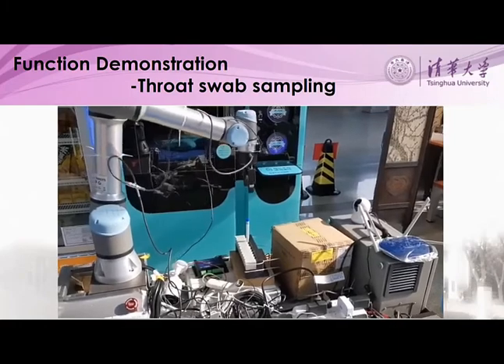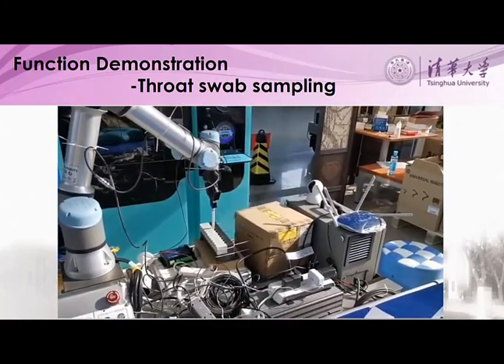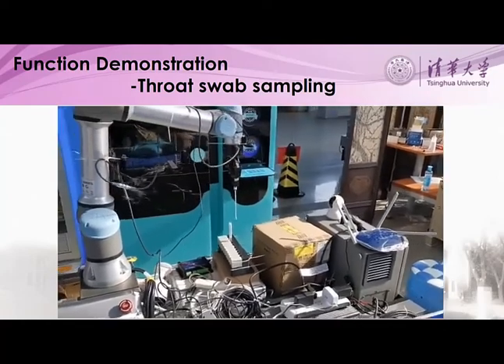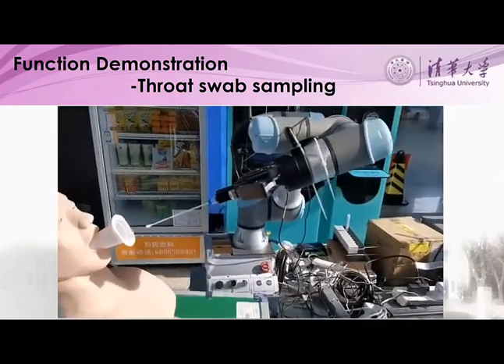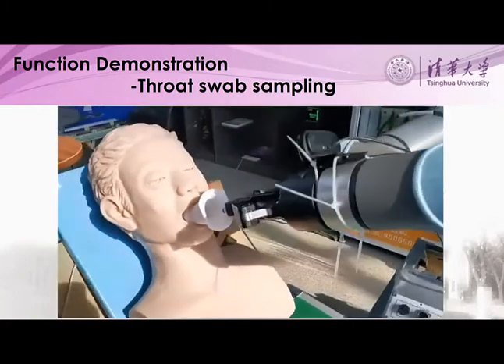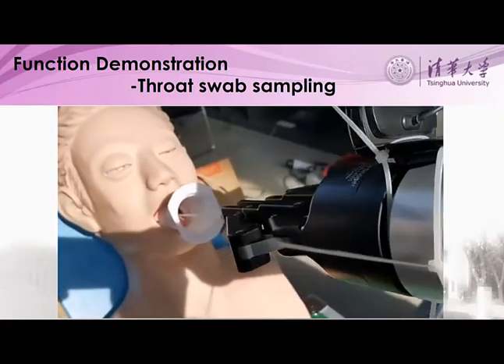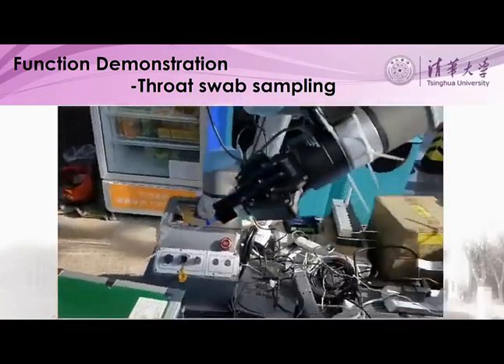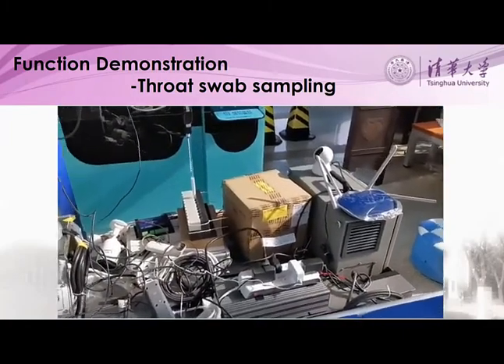This is an example of throat swab sampling. The robot arm grabs the throat swab and sends it near the bite block of the patient. Then it moves the swab axially through the bite block into the patient's throat without touching the interior. The arm moves the swab to rub the wall of the throat, taking surface samples, and then retrieves the swab, dropping it back into its test tube container.